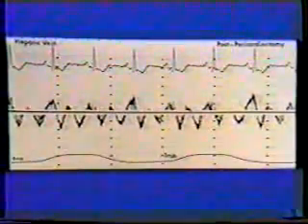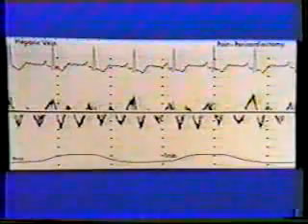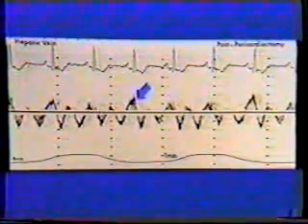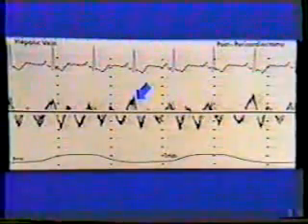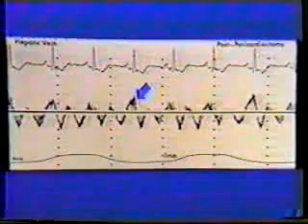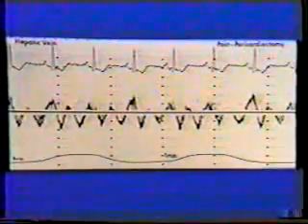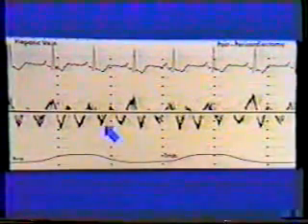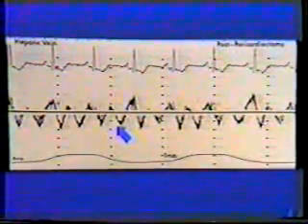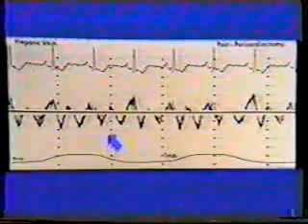Following pericardiectomy, the hepatic vein Doppler pattern has returned to nearly normal. Although there is still a prominent atrial reversal with expiration, it is reduced in magnitude compared to the preoperative findings. Most importantly, systolic and diastolic forward flow velocities are now preserved, even with expiration.